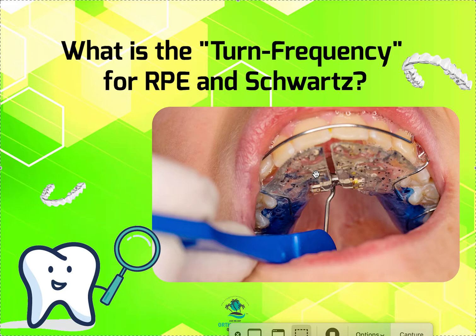But also, if you're doing upper and lower, and yes, I know lower doesn't have 2 palatal shelves, you're not actually expanding, all you're doing is widening the arch, and yes, you can do that with wires, and yes, you can do that with aligners. But if the child is in mixed dentition, it is amazingly helpful to widen those arches, especially if the lower one shows signs of crowding too, because then the teeth tend to come in straighter to begin with. In an older kid with a lot of crowding, sure, you can put wires in and brackets on and use open coil springs and slowly start to add them in, or you can just widen the arch with the expander and get more space right at the beginning. It just makes things easier to me, but whatever.